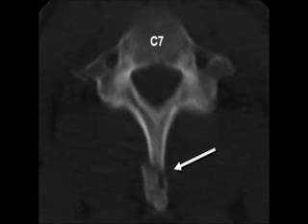This is a CT scan in another patient with a clay shoveler's fracture. The white arrow is pointing to the fracture through the spinous process of C7.